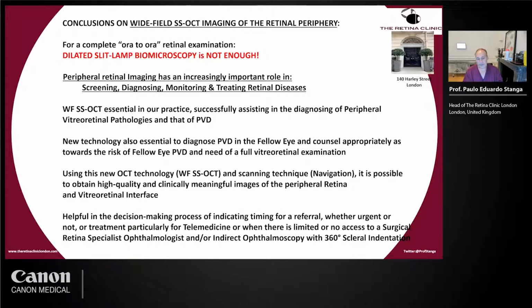Using this new technology and a scanning technique called navigation, where we ask the patient to look in different directions and we move and we position the scan in that area, it is possible to obtain high quality and clinically meaningful images of the peripheral retina and the vitreoretinal interface.